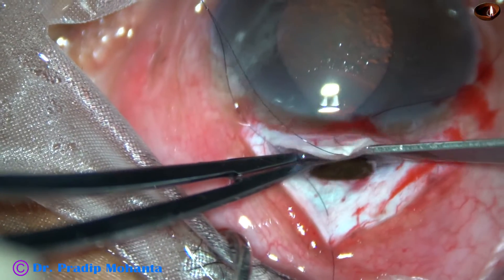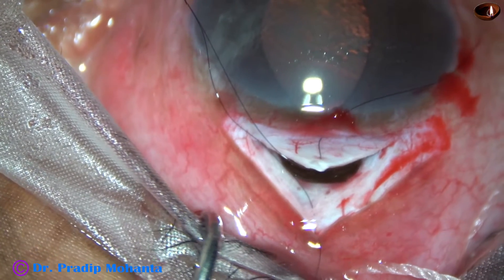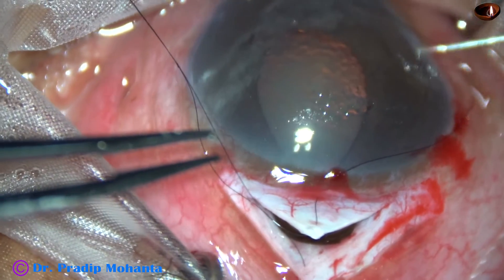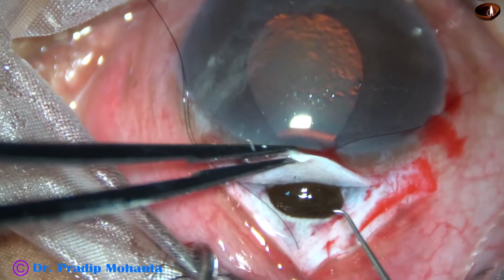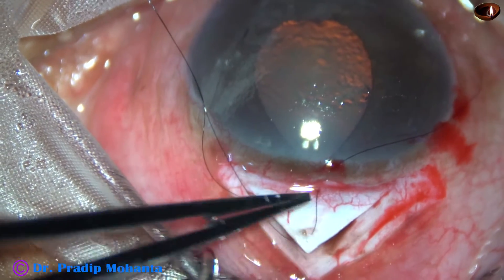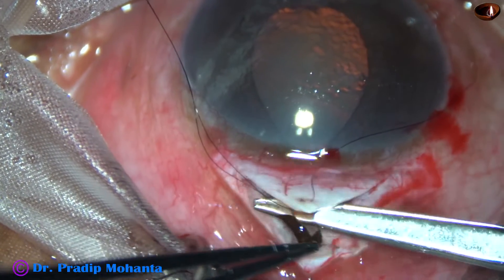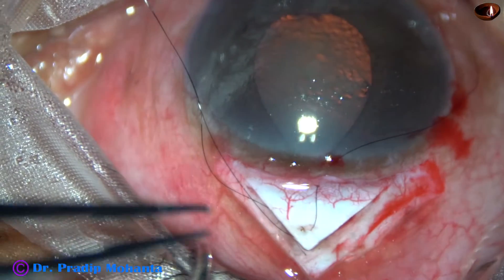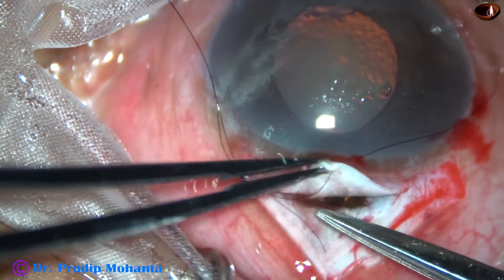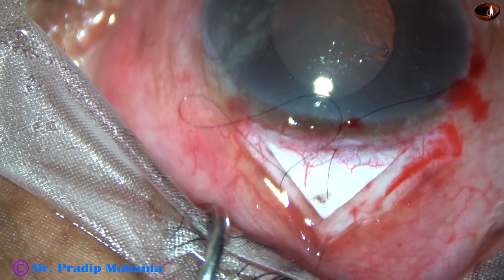The IOP is very high — about 30 — and that is why there is a prolapse of iris. Now I take a Vannas scissor. I try to reposition it partially so that I do not do a complete iridectomy. And here it is — I do a peripheral iridectomy. This is a fairly big, full-thickness iridectomy.